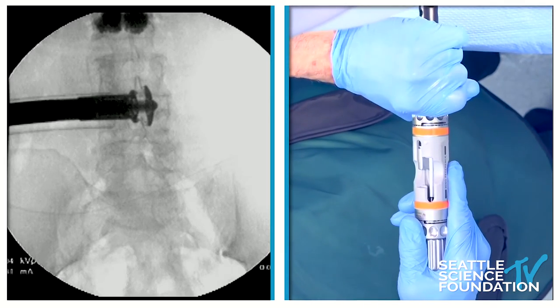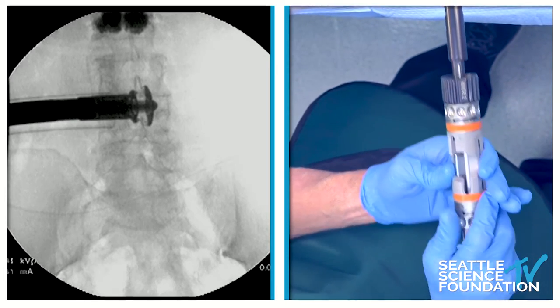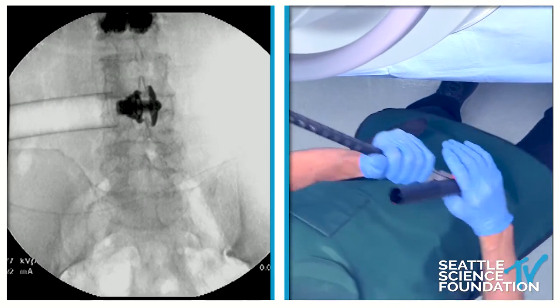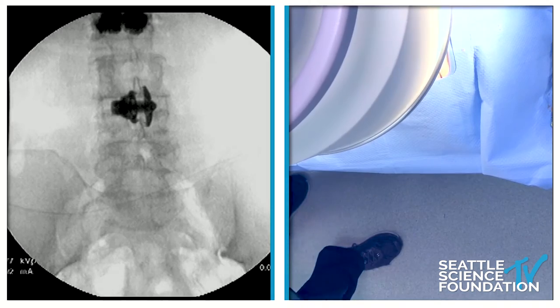The extension plate to the fixed plate is completely locked down. At this point I'm going to go counterclockwise on the posterior knob, give it a couple shakes, and go ahead and take the sleeve out. That is the final AP view. Let's go ahead and take a final lateral view so we can show everybody how this is.